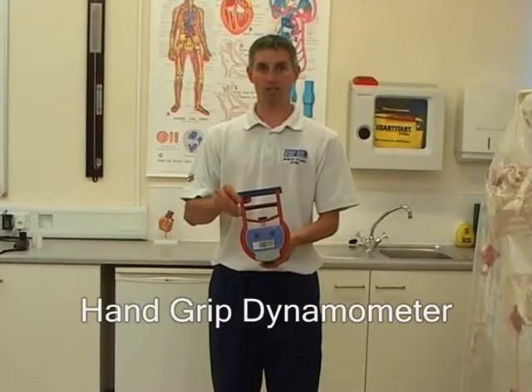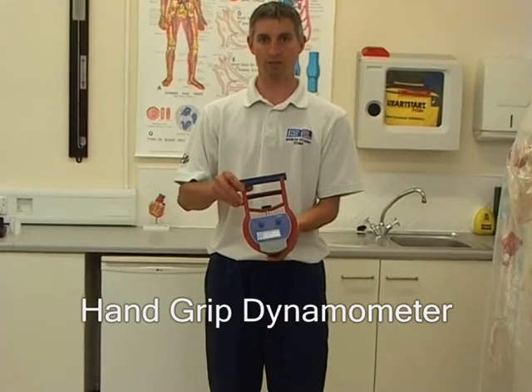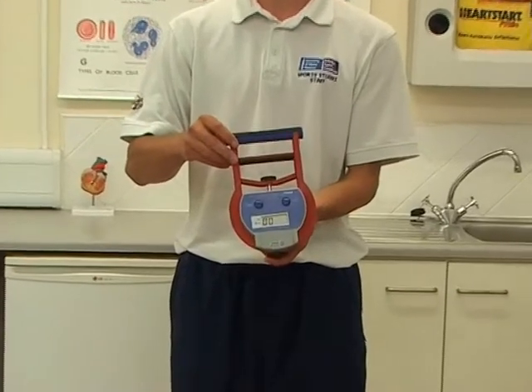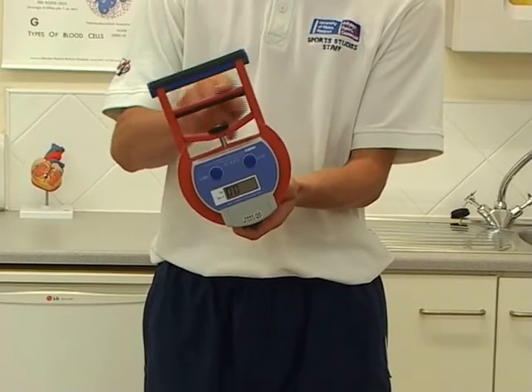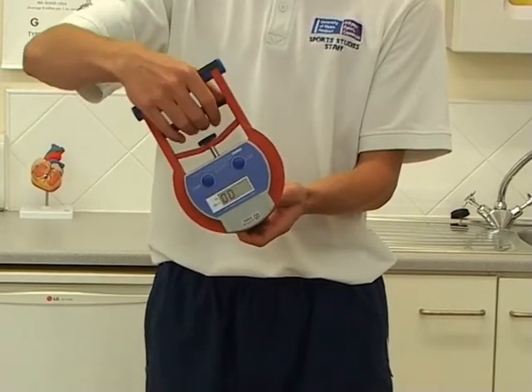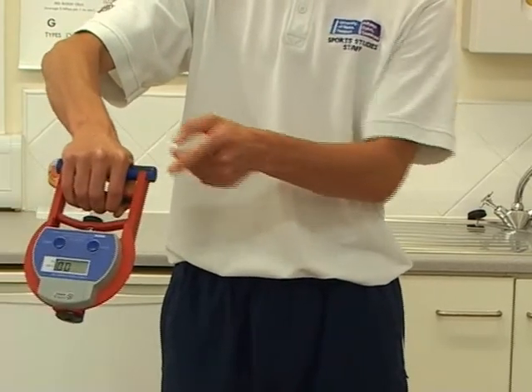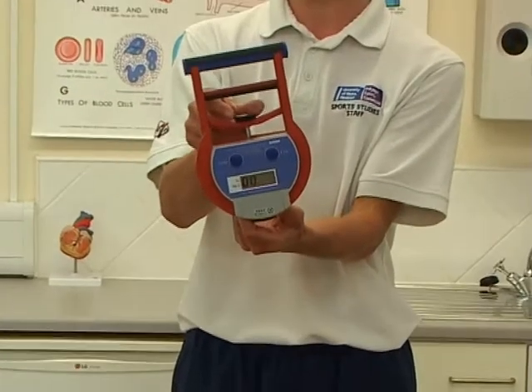This device here is a hand grip dynamometer. It measures grip strength of your forearm in kilograms. The device is first set up so that this sliding bar allows a 90 degree angle with your knuckles when placed in your palm. You adjust it simply by altering that dial there.